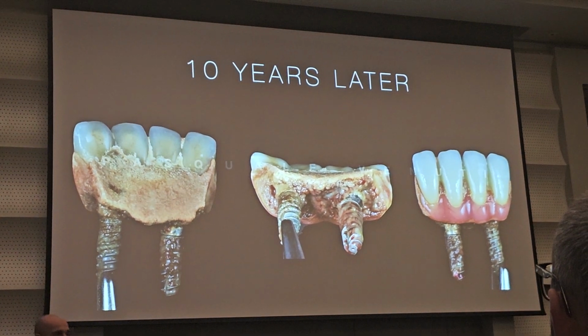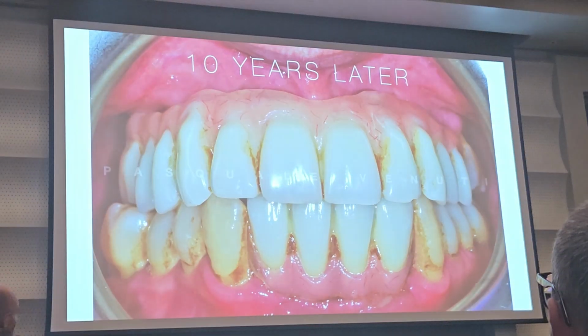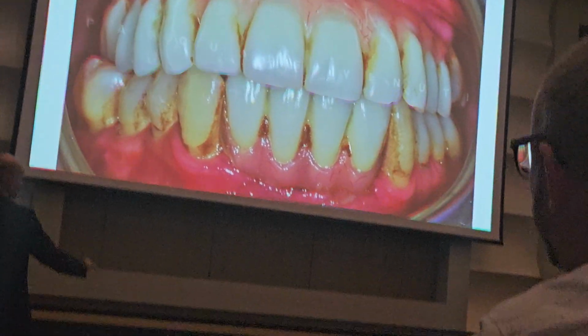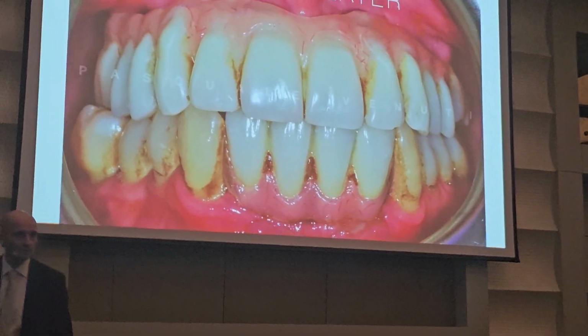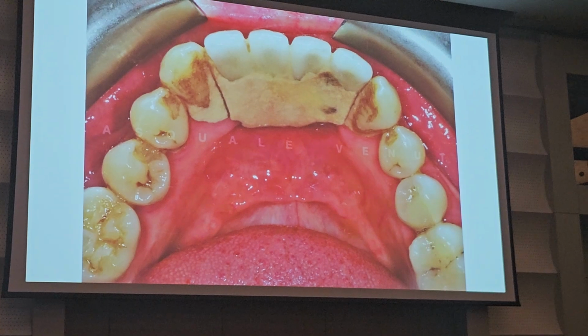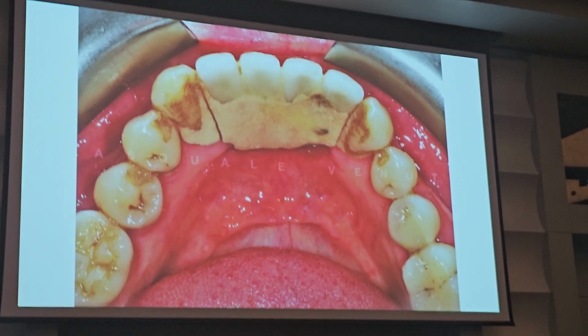This is mine, this is mine. In this patient, I did a full arch case of the upper arch, and the same day I placed 2 implants on the lower incisors, and I placed this prosthesis. The patient never showed up at the office till the day that the prosthesis started to move.